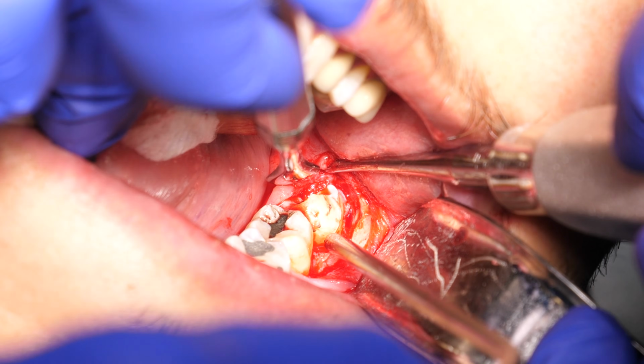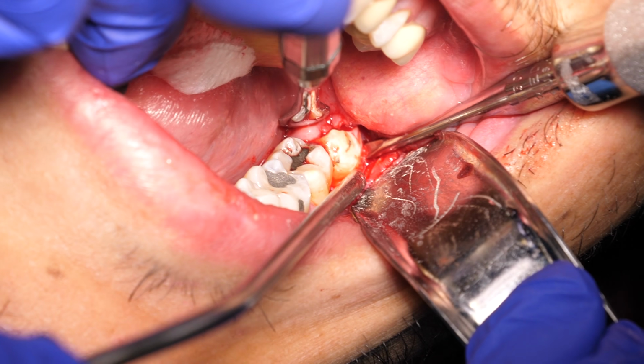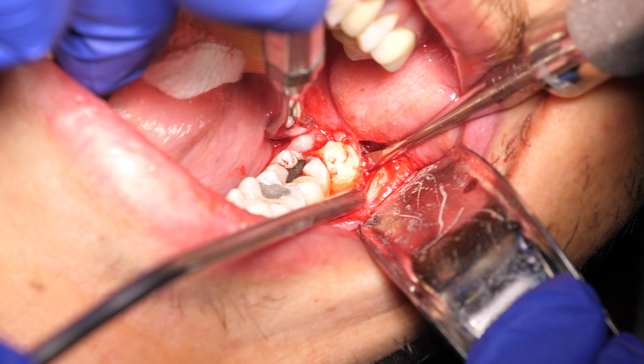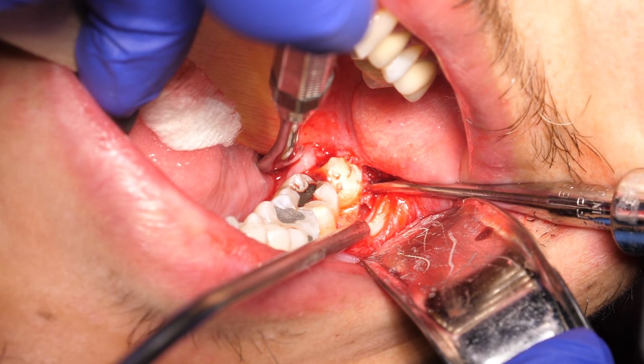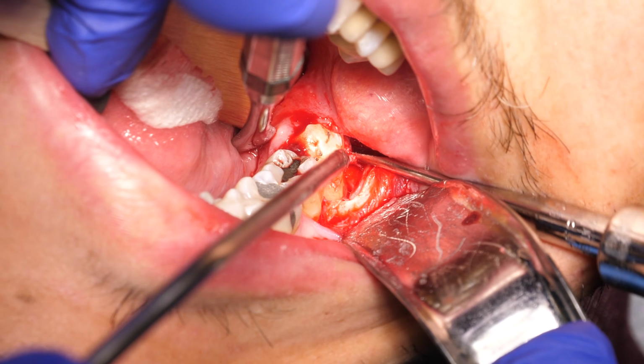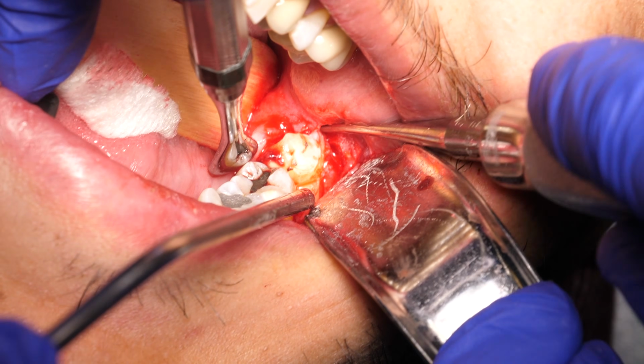If there is no mobility, then sectioning of the crown and roots should be done. Sectioning will depend on the type of impaction, angulation, and the roots. It can be done either buccolingually or mesiodistally. Avoid going through the whole crown to prevent lingual cortical perforation because of the close lingual nerve approximation.